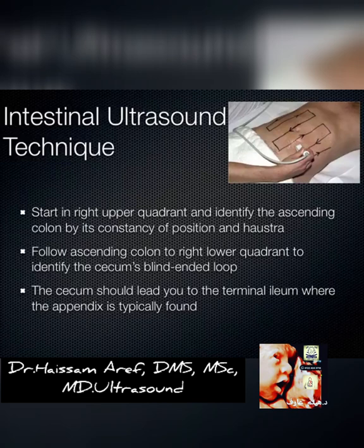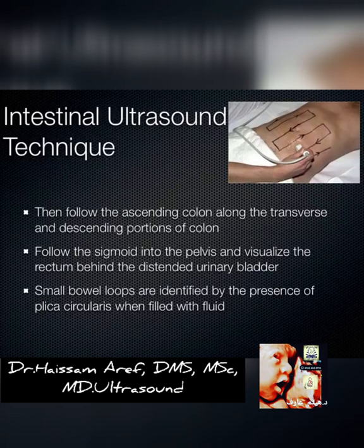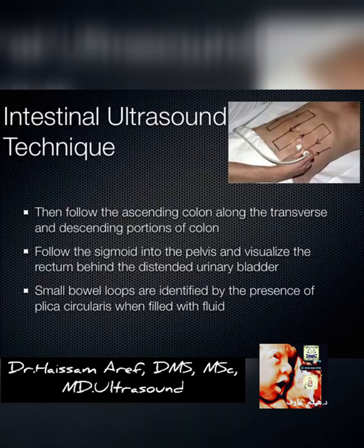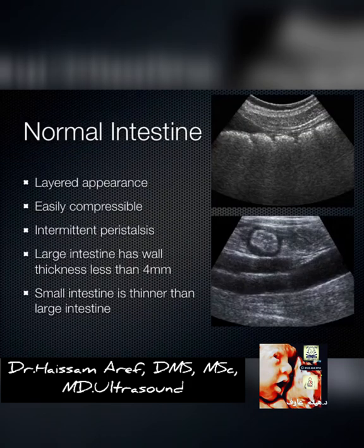You follow the ascending colon down to the right lower quadrant, where you expect to see the cecum with its blind-ended loop, which brings you to the terminal ileum where the appendix juts off. Then you go back up the ascending colon, across the transverse, and down the descending colon. You'll see the sigmoid down in the pelvis, and the rectum is very easy to see almost always — right behind a nice fluid-filled bladder. Differentiating small bowel from large bowel is difficult with air-filled loops, but in disease states you can make out the plicae circulares.